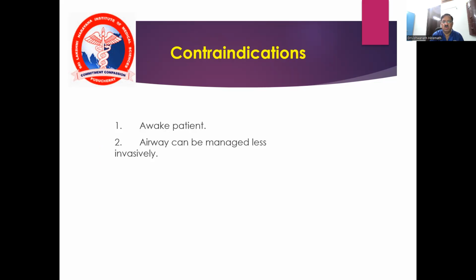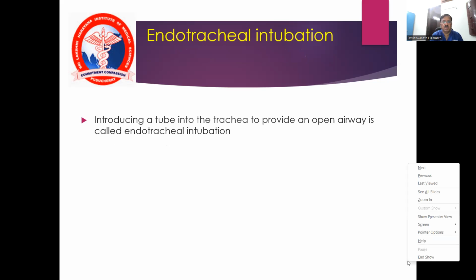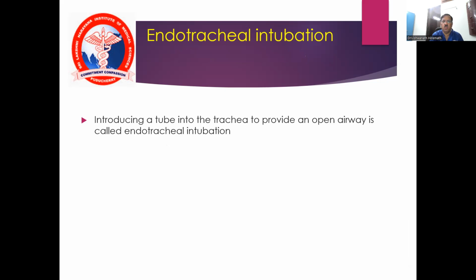Contraindication: we cannot do endotracheal intubation in an awake patient. When it is possible to manage the airway in a non-invasive or less invasive way, it is better to avoid endotracheal intubation because it itself is associated with complications. So, again I am repeating, endotracheal intubation is introducing the tube into the trachea to provide an open airway.